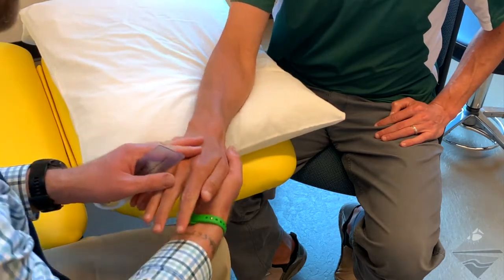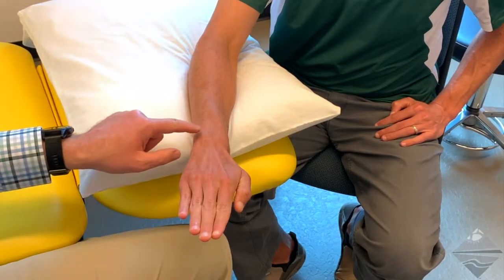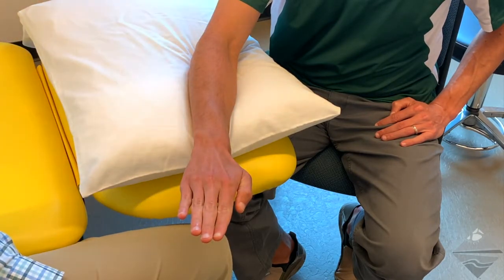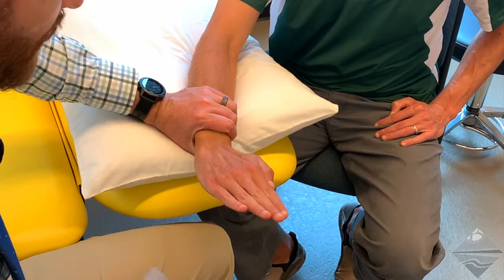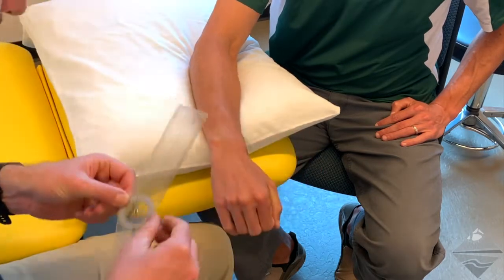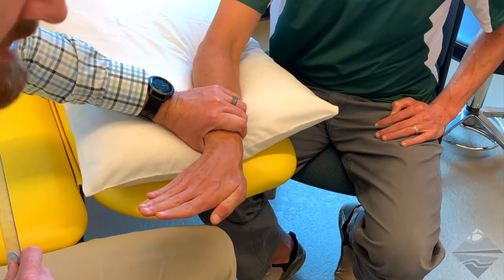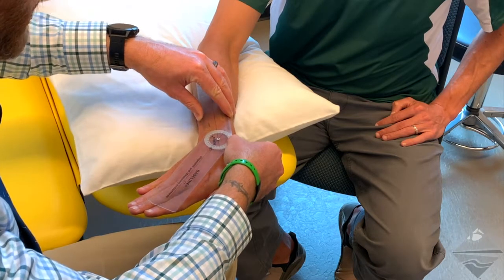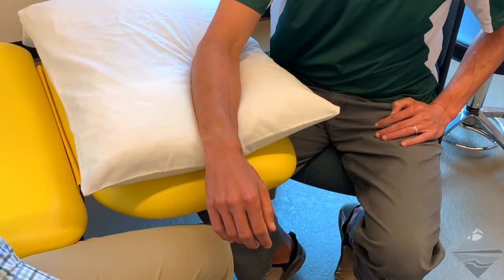We're ready to look at ulnar and radial deviation, recognizing that the radius will extend just a little bit further distal than the ulna. Approximately a 2 to 1 ratio — meaning for every 2 degrees of ulnar deviation, they should have approximately 1 degree of radial deviation. First, we're going to have the individual radially deviate. You're bisecting the radius and the ulna, find the third metacarpal, and take your measurement. This individual has approximately 18 degrees of radial deviation. Conversely, for ulnar deviation, the process is the same: bisect the radius and ulna at the wrist joint, find the third metacarpal, and take the measurement. The individual demonstrates 35 degrees of ulnar deviation — almost a 2 to 1 ratio as expected.